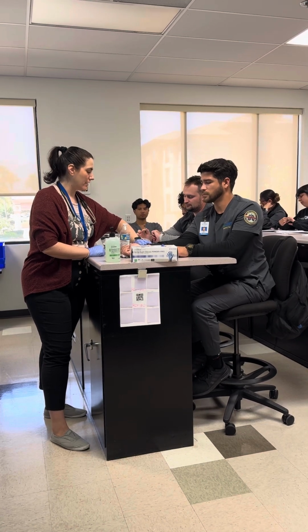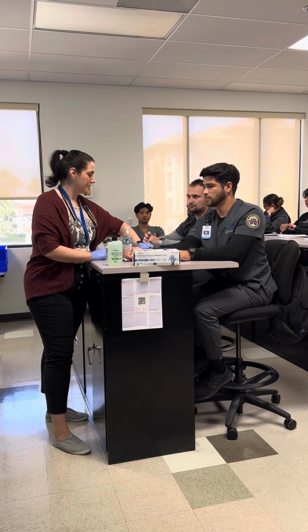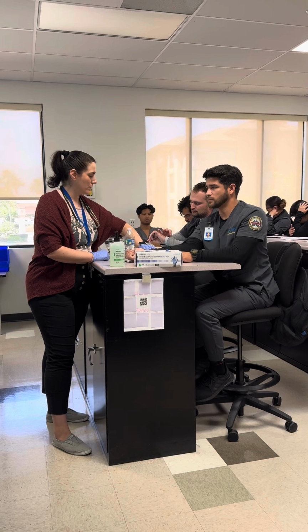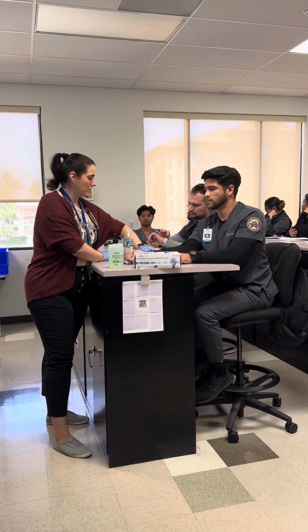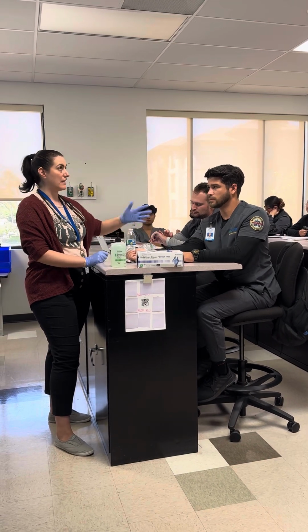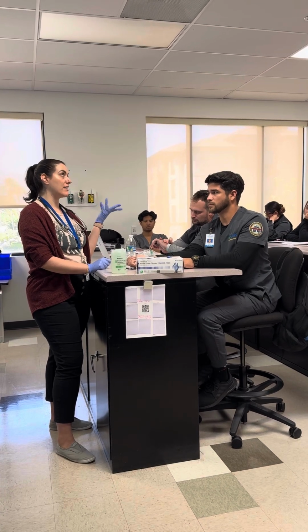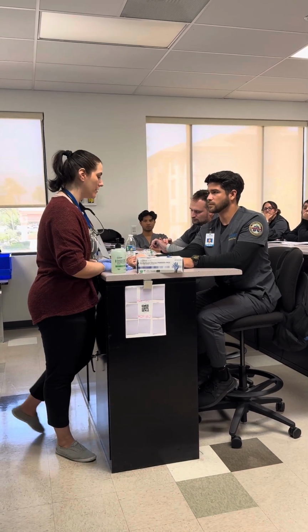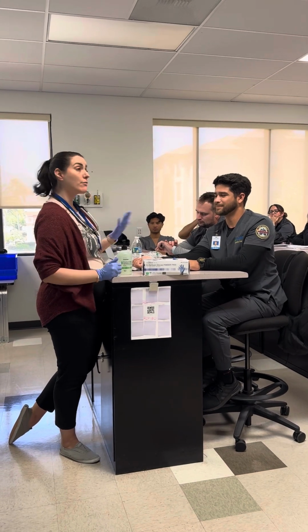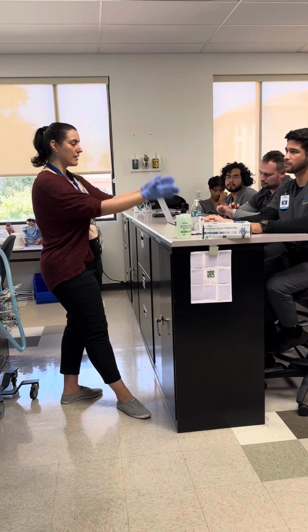So now I'm at that 15 seconds. So I think I got a little under 20. I'm going to say that was 19. So not 20, so that's not 20, 40, 60, 80, that's 76. I looked down at his pulse oximeter, it says 73. That's correlated. Pat on the back for me. That's what I want to see from you guys. It's reading 76, 77 right now. That means whatever I'm feeling, it's matching on the machine here.